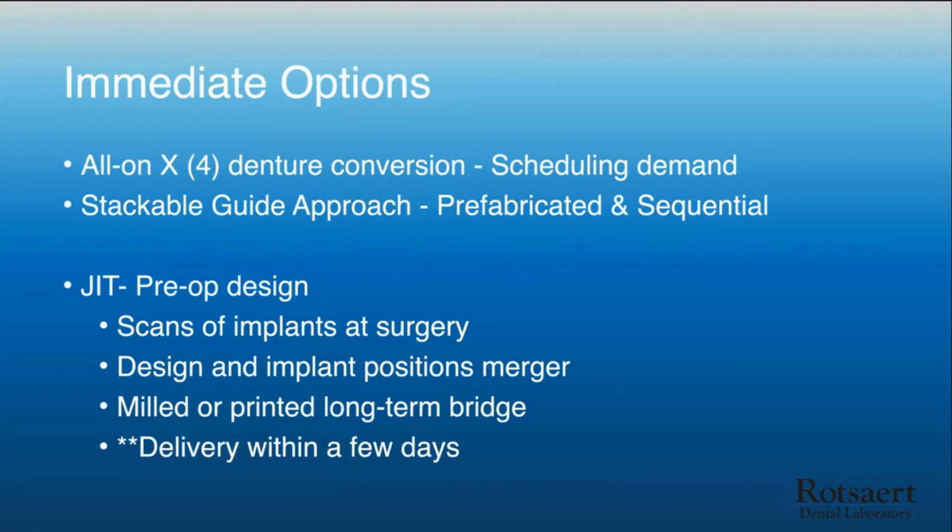And we mill or print a long-term bridge, right? Usually next day for those or 2 days, but we're definitely within the window of appropriate immediate loading. We're not pushing the limits of integration at that point. So again, you do it within a few days. And the reason I like this is you get a much more elegant bridge that's done because we're designing it to implants that are placed. We're not taking a denture, hollowing it out and grinding it up and leaving it bulky for strength. We can then really design a nice bridge for those patients. And it really, really works well, right?